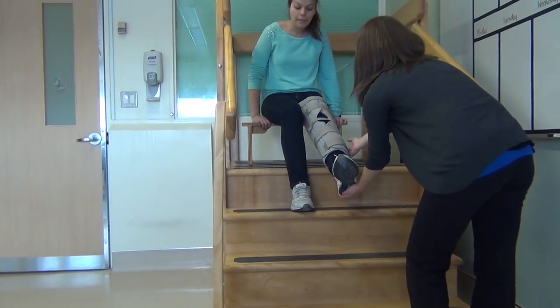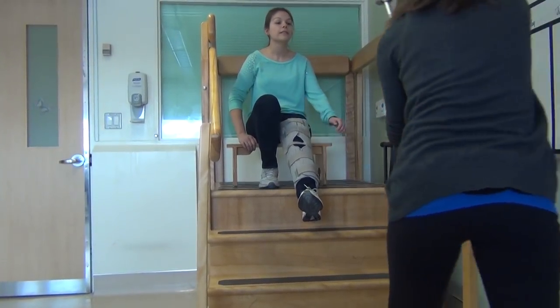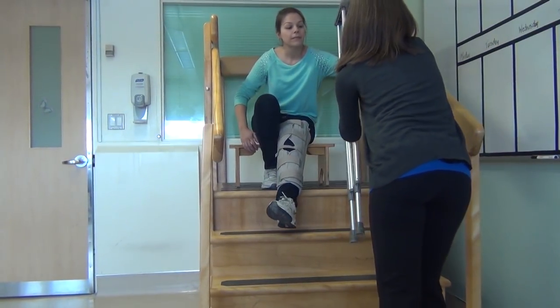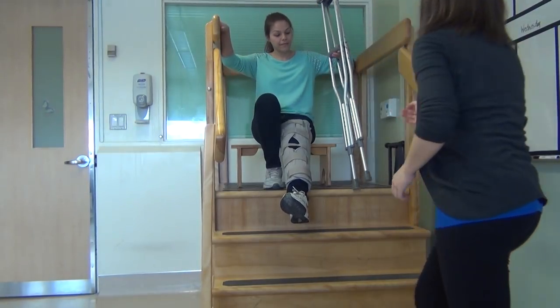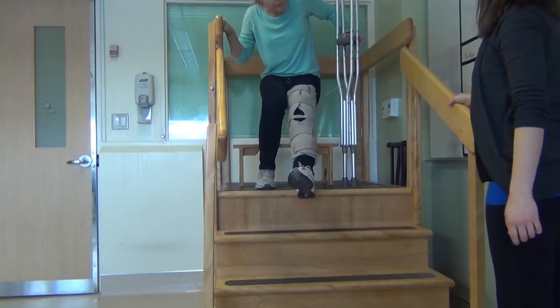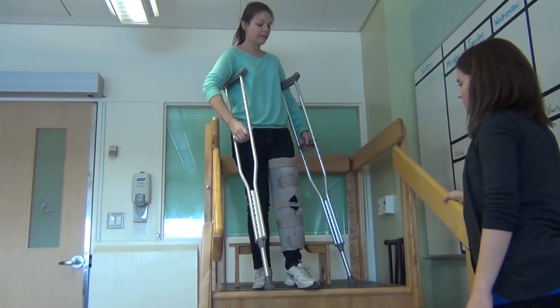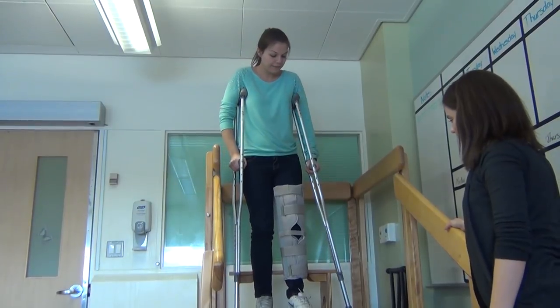Have a small bench or stool waiting at the top of the stairs — this makes it easier and safer to get up. Place both crutches in the same hand. Push down on the handles with one hand and hold onto the handrail or an adult with the other to get yourself up off the bench, similarly to getting out of a chair. You may place your injured leg on the ground for balance.